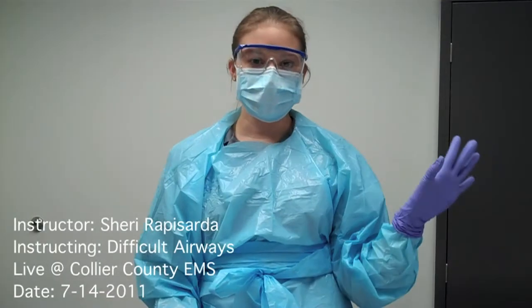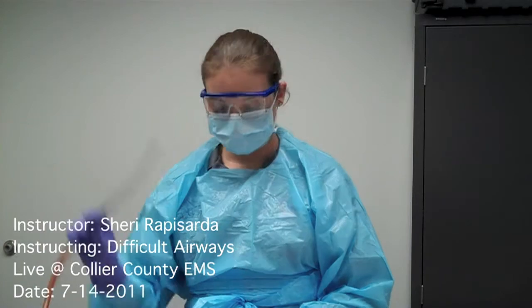Hello, I'm Sheri Rapisarda. I'm an EMT with Collier County EMS, and what I'm demonstrating today is obstructed airway with king tube insertion.